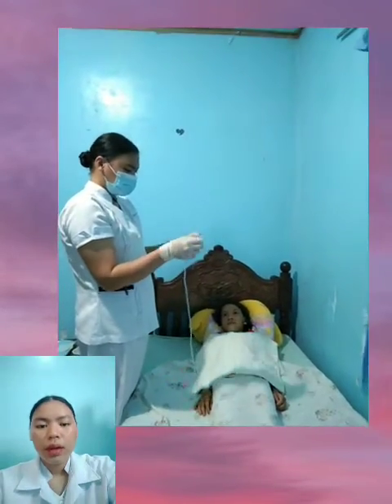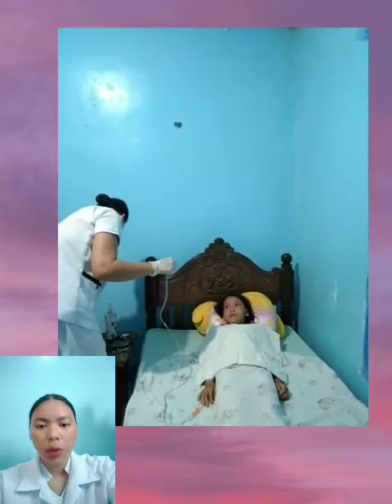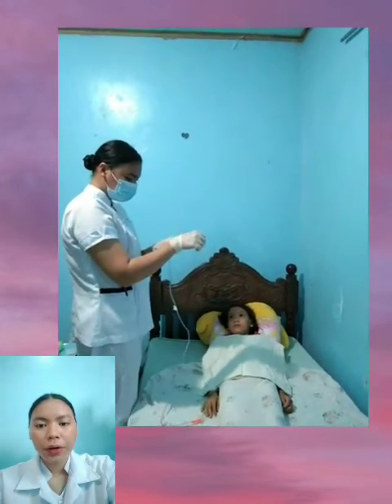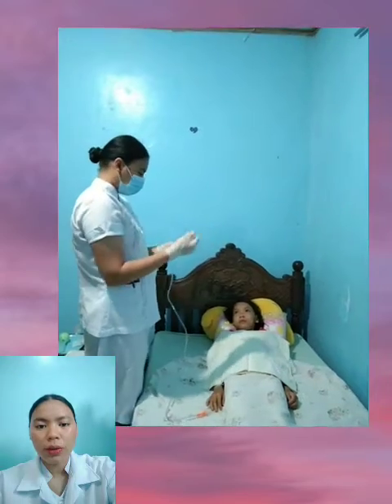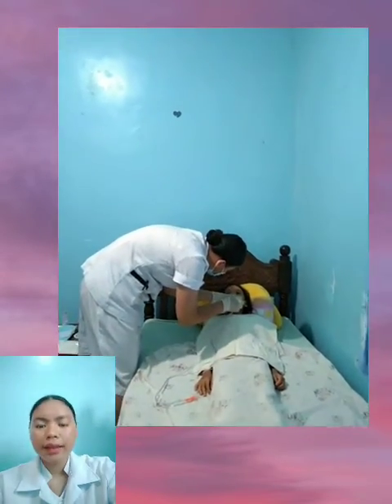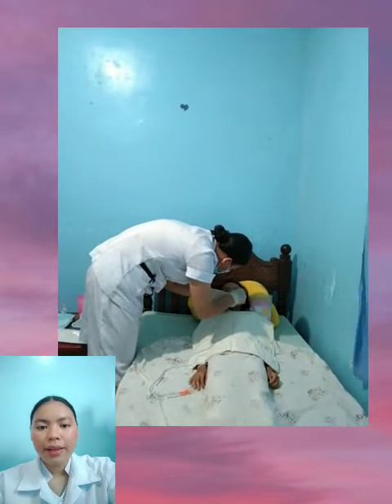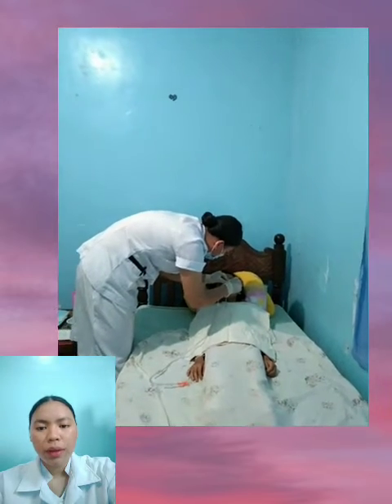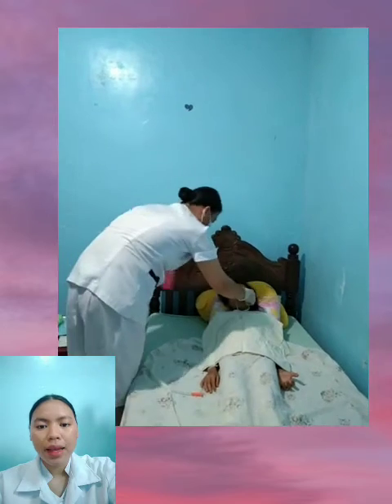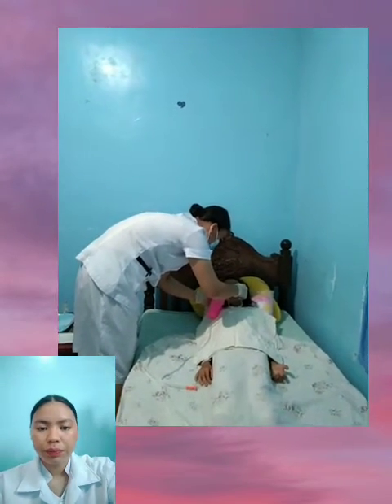Insert the tube. Lubricate the tip of the tube well with water-soluble lubricant or water to ease insertion. Insert the tube with its natural curve toward the client into the selected nostril. Ask the client to hyperextend the neck and gently advance the tube toward the nasopharynx. If the client gags, stop passing the tube momentarily. Have the client rest, take a few breaths, and take a sip of water to calm the gag reflex.